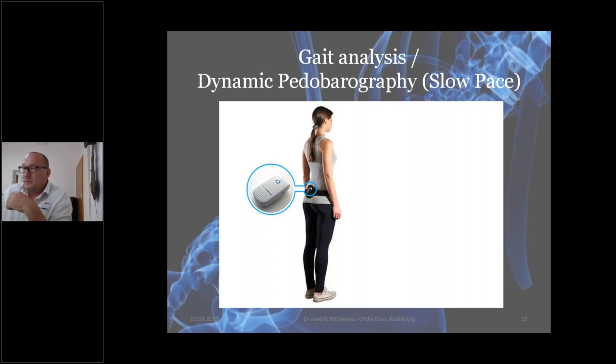And the time that you need to attach this device to the patient and to do the measurement is actually not an extended time interval. So you can actually do this on almost every patient every day, as we do. Eight weeks down into treatment, this is our standard screening tool.